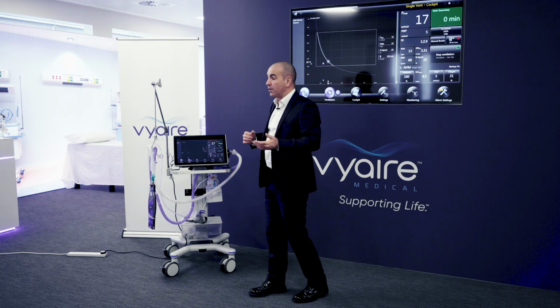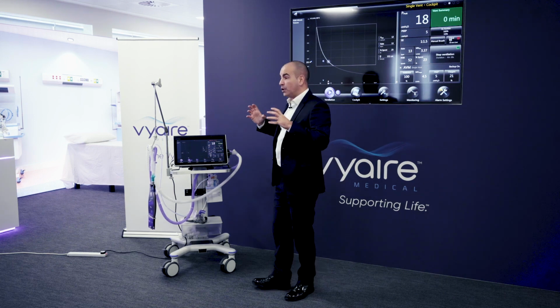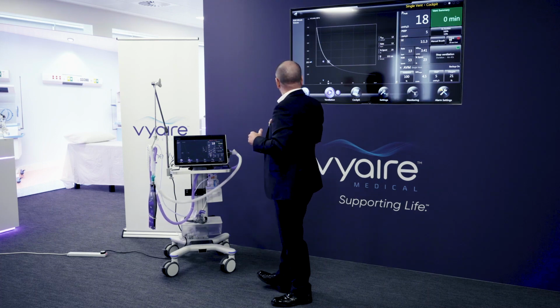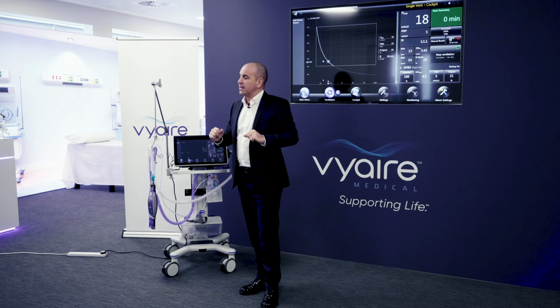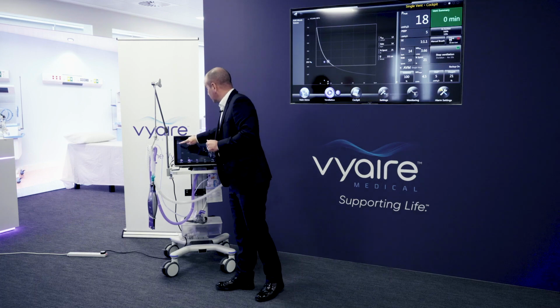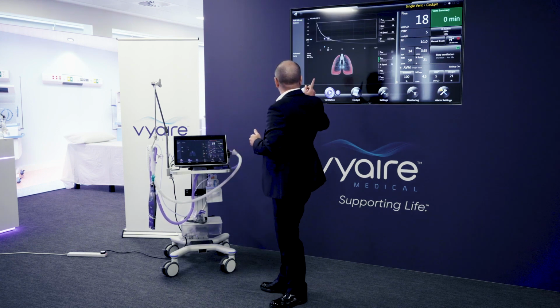So when the doctor walks on, they don't even have to concern themselves with the numbers. They would have that visual cue there straight away, illustrating to them what's going on with their patient. So this will end up more of a horizontal, flatter type rectangle. It pairs nicely with the animated lung. So if we add that lung that we had before, so the two go together nicely.